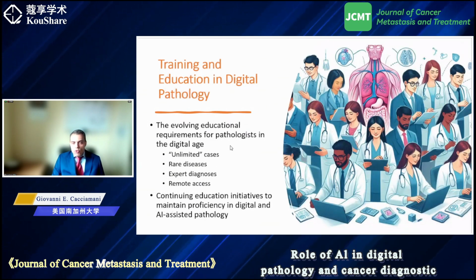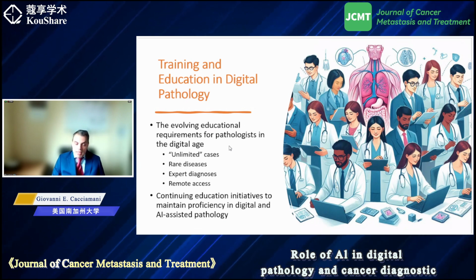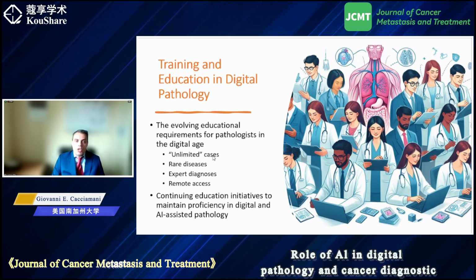But very importantly for academicians, as some of us are, is the training possibility with digital pathology. In fact, right now, the training in pathology is limited by the number of microscopes and by the availability of specific cases in a given center. It is very easy to have a large portfolio in the biggest hospital, but when we go to smaller hospitals, smaller universities, and maybe less developed countries, it could be very difficult. With telepathology, we may train our young doctors with basically unlimited cases, including rare diseases.